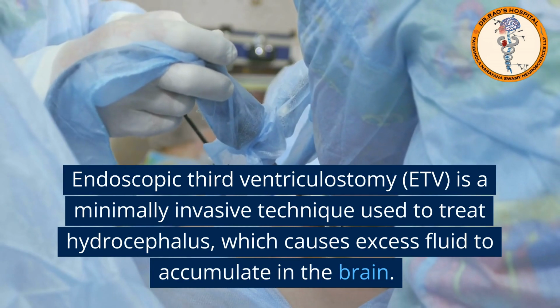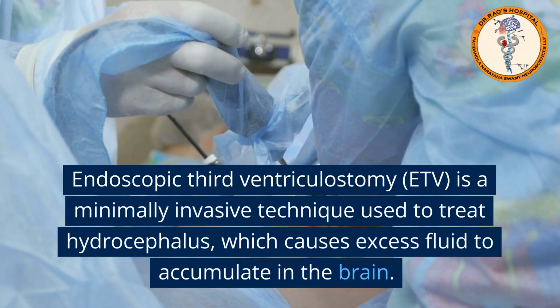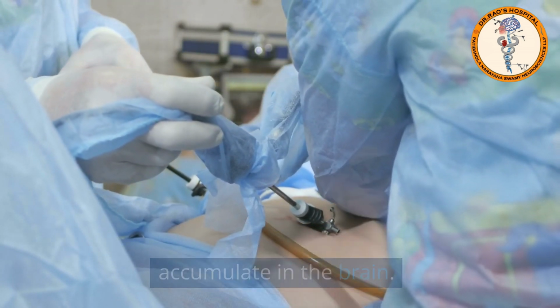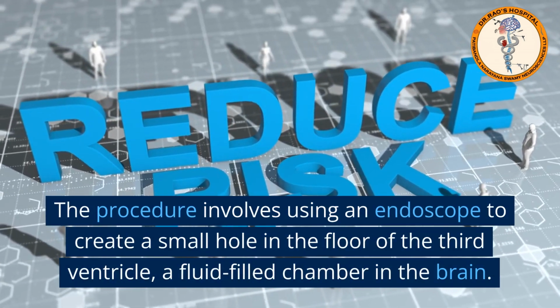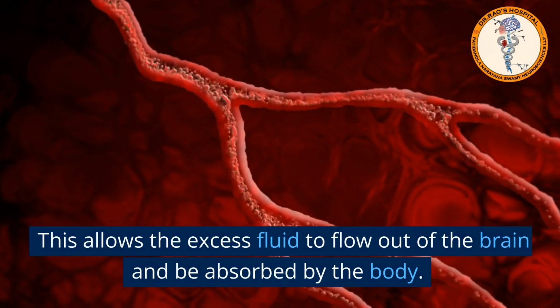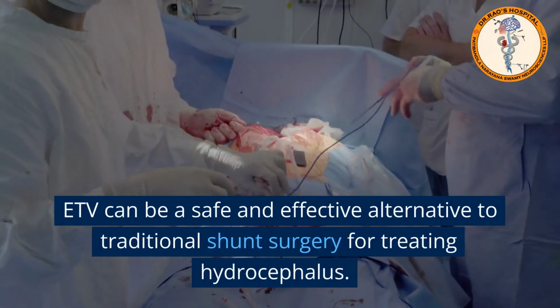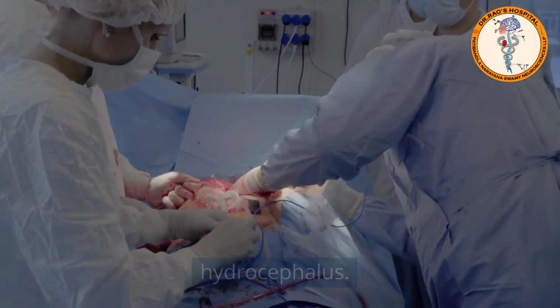Endoscopic third ventriculostomy, ETV, is a minimally invasive technique used to treat hydrocephalus, which causes excess fluid to accumulate in the brain. The procedure involves using an endoscope to create a small hole in the floor of the third ventricle, a fluid-filled chamber in the brain. This allows the excess fluid to flow out of the brain and be absorbed by the body. ETV can be a safe and effective alternative to traditional shunt surgery for treating hydrocephalus.